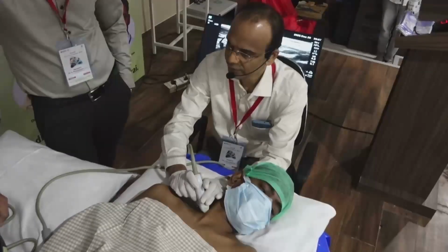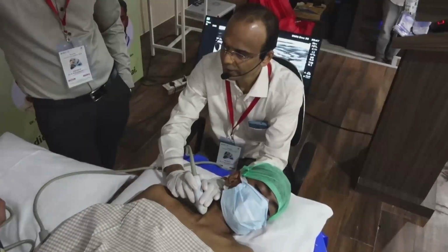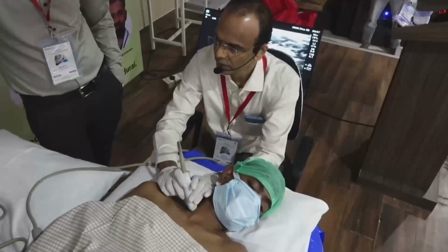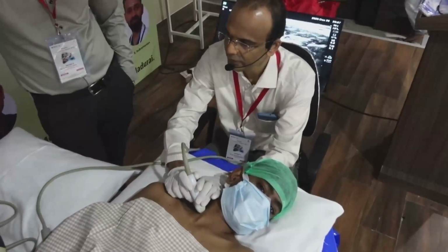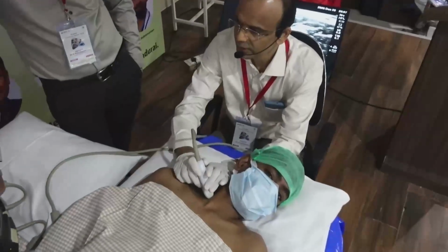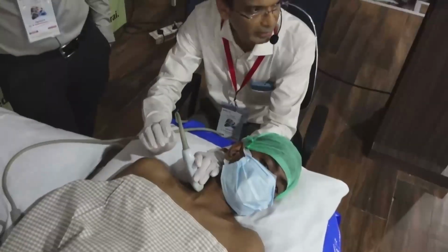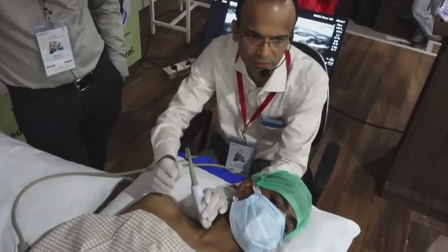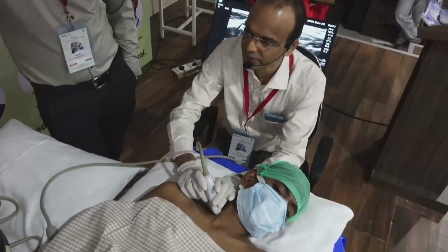So now if I scan medially and laterally, first we will start with C5. Every root or ventral ramus comes out of the vertebral foramen, and from there we are going to identify it.